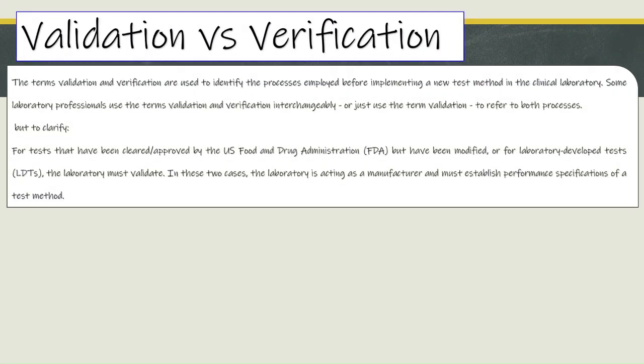Validation versus verification. The terms validation and verification are used to identify the processes employed before implementing a new test method in the clinical laboratory. Some laboratory professionals use the terms validation and verification interchangeably or just use the term validation to refer to both processes, but to clarify.